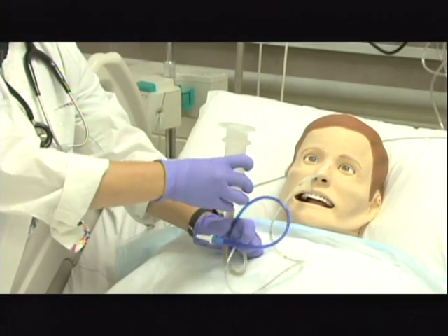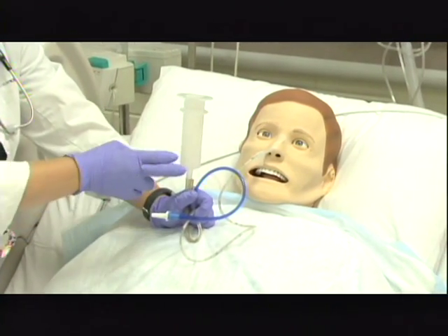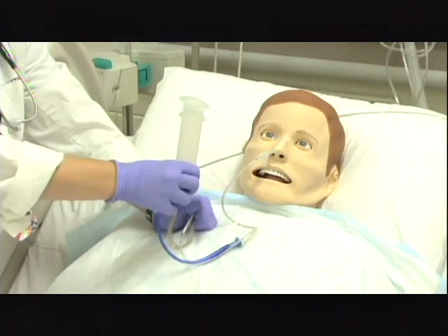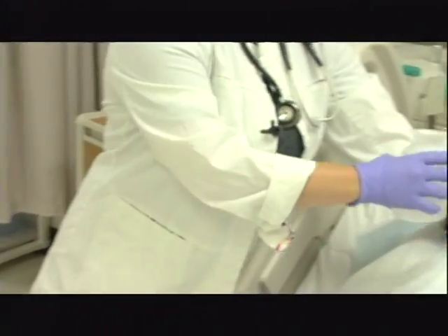So I need to keep it clamped in my hand, and you'll notice you have to have four hands to do this. I've got it clamped, and this is here. I also don't want to let this fling around. Obviously, I hit the patient, but things could spill down in his lap. So what I'm going to do is come over here, and I need to irrigate the tube.